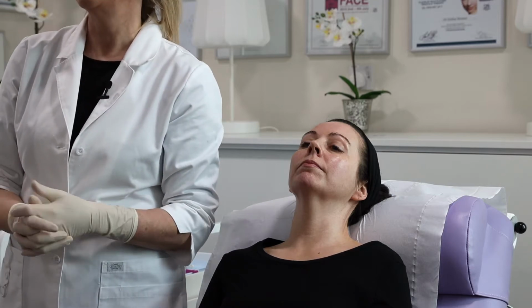Today we're going to be focusing on the foundation or mid-face codes. Our patient is 42 years of age and has had no previous dermal filler treatment. She's got a very attractive face. She does have some inevitable sequential changes that are happening over time. So she's got some photoaging of her skin and some loss of skin elasticity. She's particularly got some volume loss in her fat pads, and these follow a predictable sequence over time.